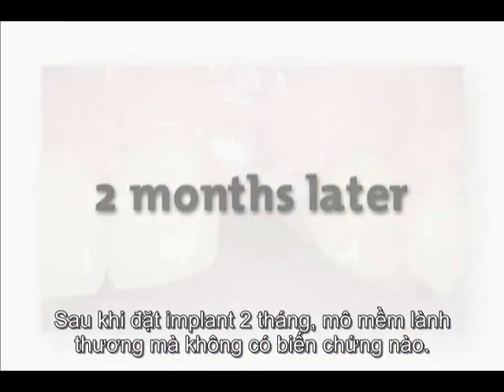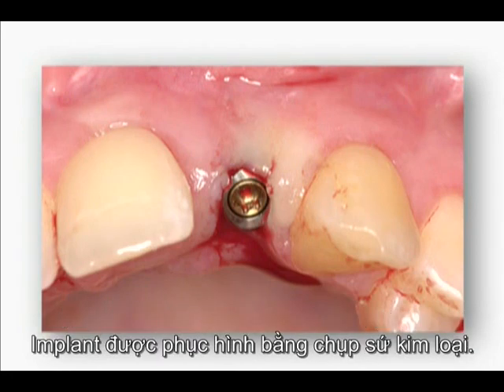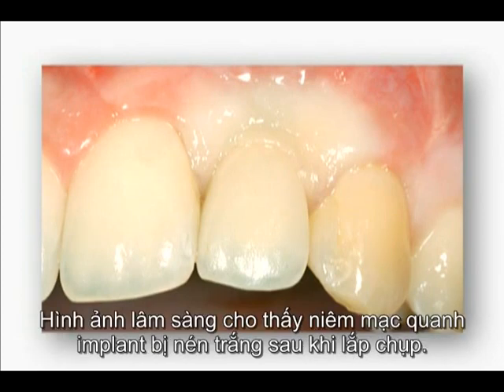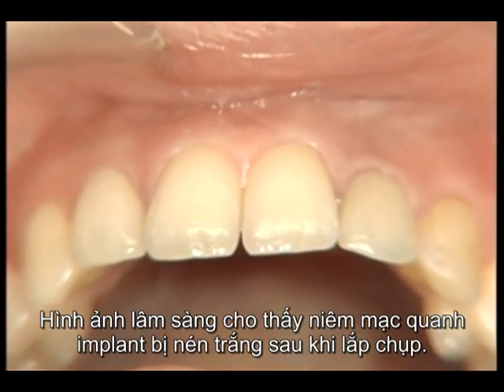Two months after implant placement, soft tissue healing is free of complications. A punch excision was used to reopen the site to apply a titanium healing cap. The implant is restored with a ceramo metal crown. The clinical status demonstrates how the peri-implant soft tissues have been blanched by the inserted crown.